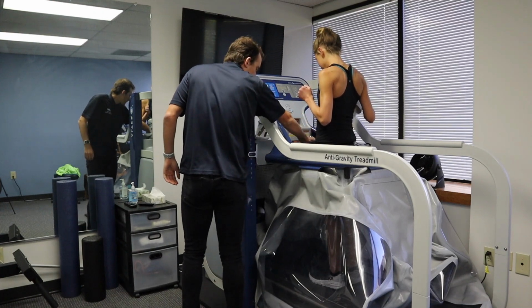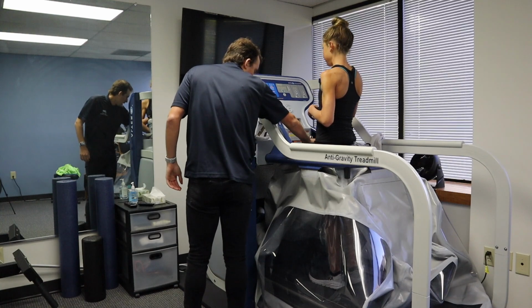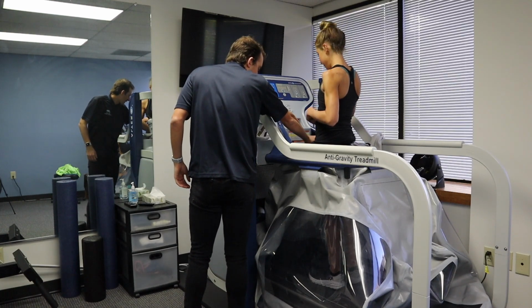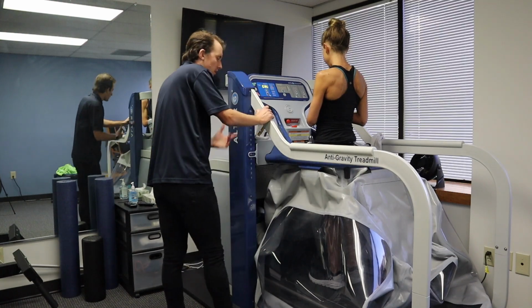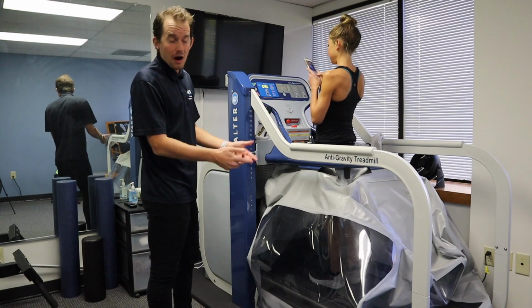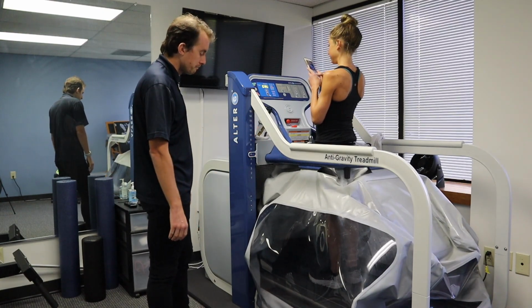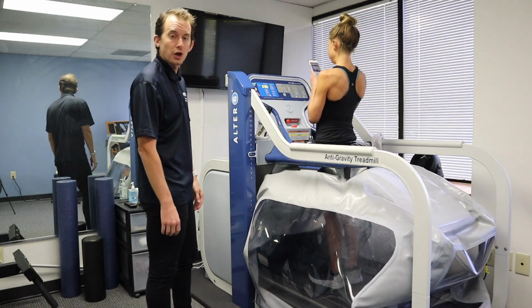All right, so once she's zipped in, we turn on the machine for takeoff here. And it's got to calibrate her body weight. That way it's exact to whatever Caroline weighs. So the machine's going to do its thing. It's a little bit loud. And then, once it's done in about 20 or 30 seconds, the fun will start.